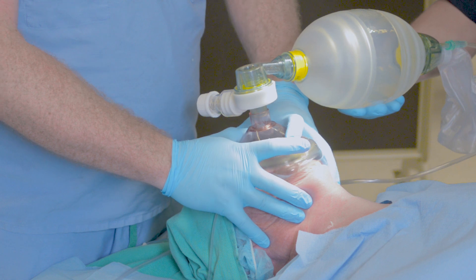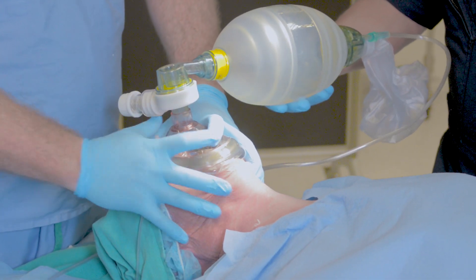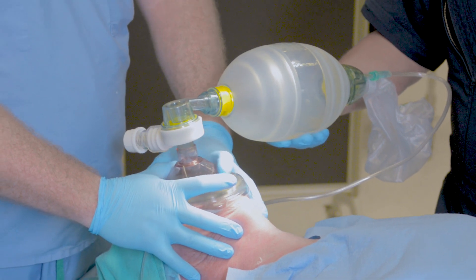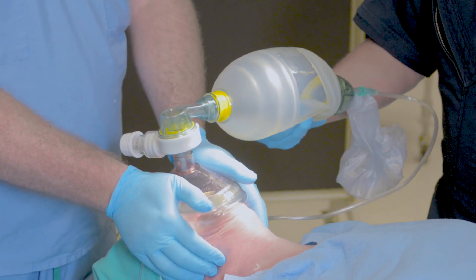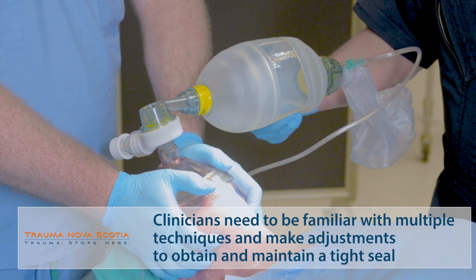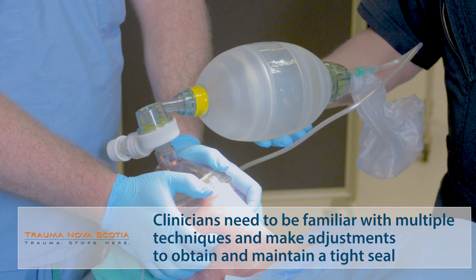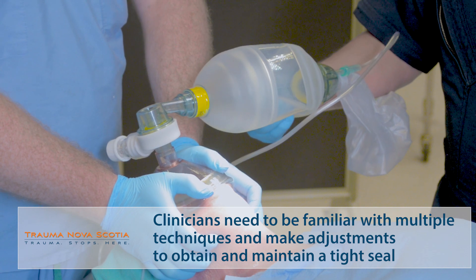You can hold the mask with a number of different hand positions — either with the C or E technique — and when your hands begin to fatigue, by moving to the thenar eminence of the thumbs and pulling the mandible up into the mask. Remember always that this is lifting the patient's face up into the mask, not pushing the mask down onto the patient.